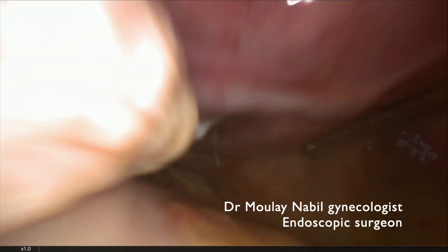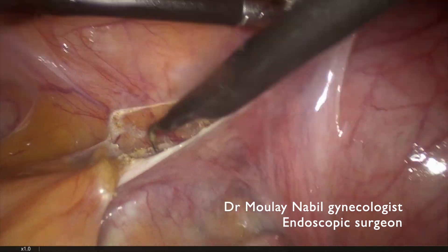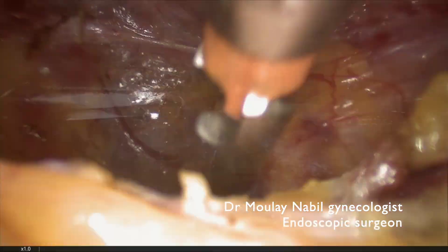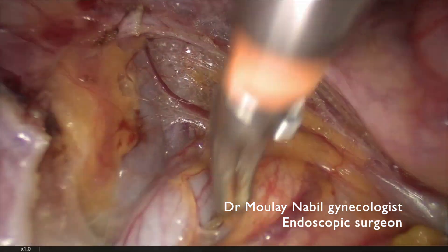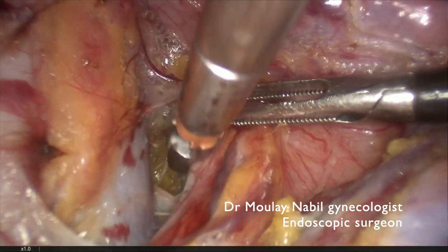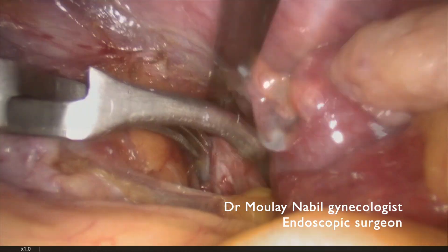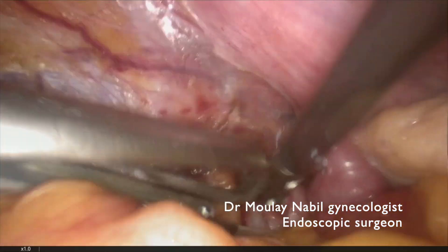We present a case of challenging polymyomectomy for expert laparoscopic endoscopic surgery. To do this challenging surgery, it's important to control both internal iliac arteries by bulldog clamp to decrease the risk of perioperative bleeding, which allows us to decrease the risk of open procedure after laparoscopy.